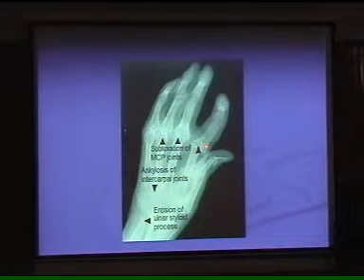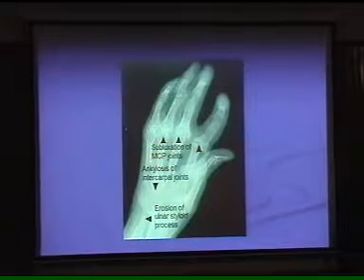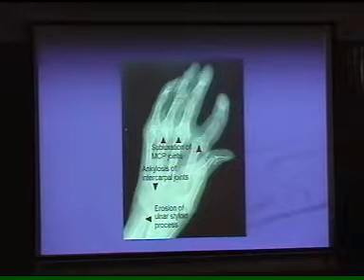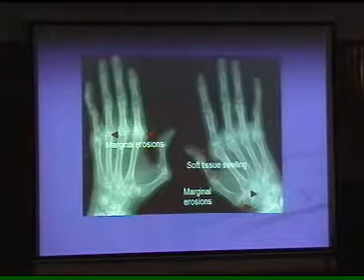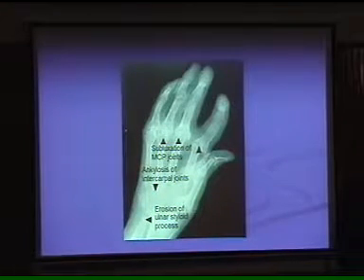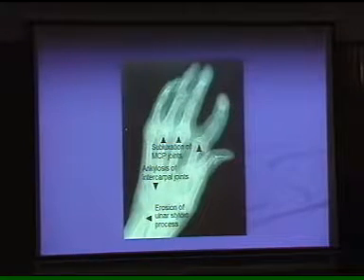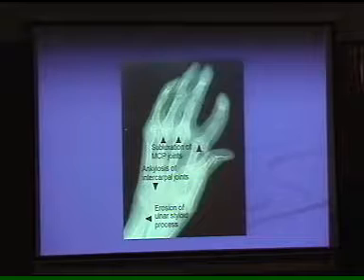Look at this subluxation of the joint spaces over there, and MCP stands for the metacarpophalangeal joints, and ankylosis. A stage comes when all these 8 bones of the carpus you can't appreciate. I'll show you one of the exercise slides over here. Here you can appreciate the joint space, but look at this. All these 8 carpal bones completely become decreased in density. The joint space is totally finished, almost narrow, and there are multiple erosions, and the movements are very much restricted. That's in the advanced stages.